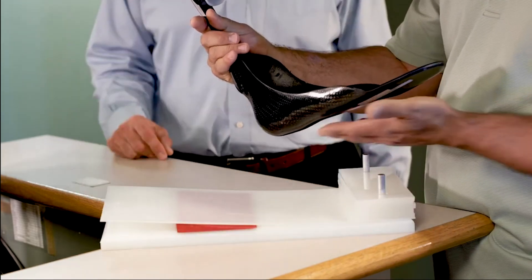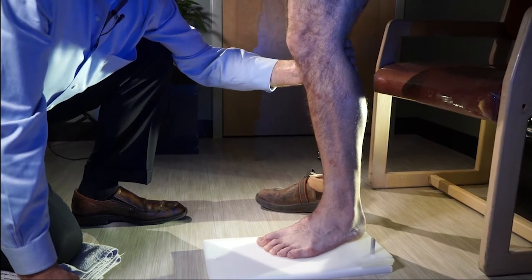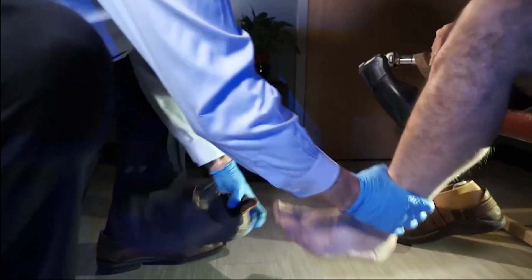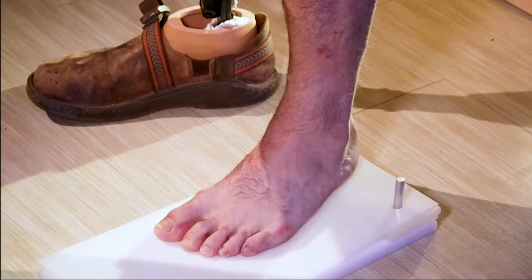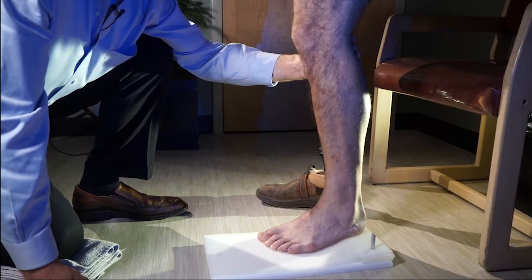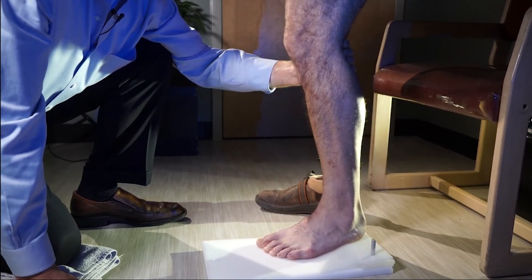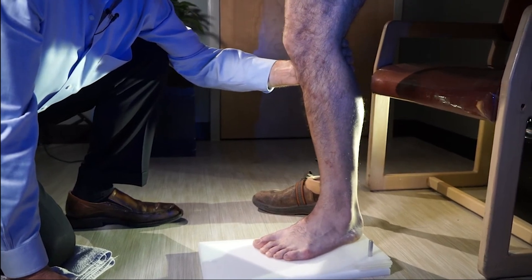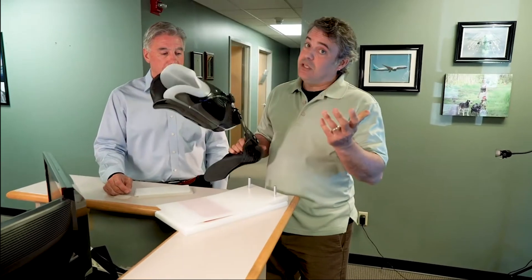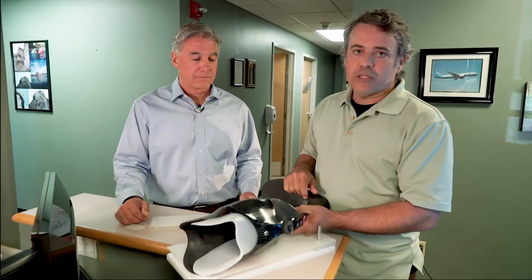For the reactive brace to properly function, the cast is going to have to capture the patient's neutral shin alignment while standing. In most cases the patient's choice of footwear is going to dictate what that needed heel height will be — for example, a three-eighths inch heel height for a three-eighths heeled shoe. However, in cases like bone-on-bone pain or failed fusion, it's really common to have to determine a specific heel height to keep them out of pain while standing and walking. Before we can do any of this, we have Dave walk us through the evaluation process.